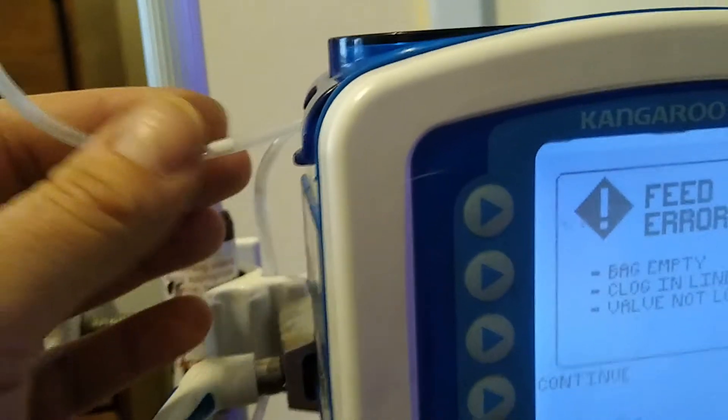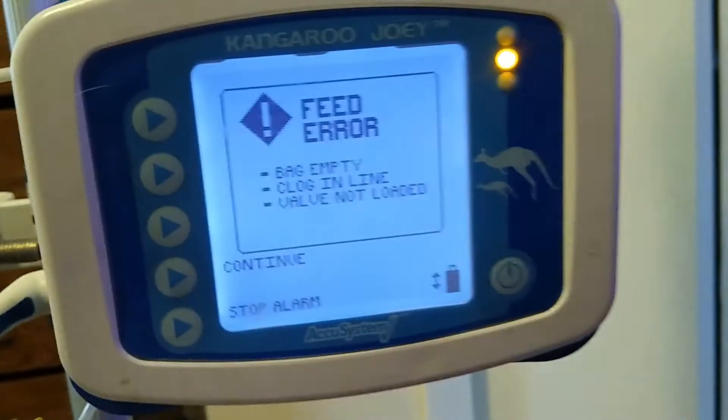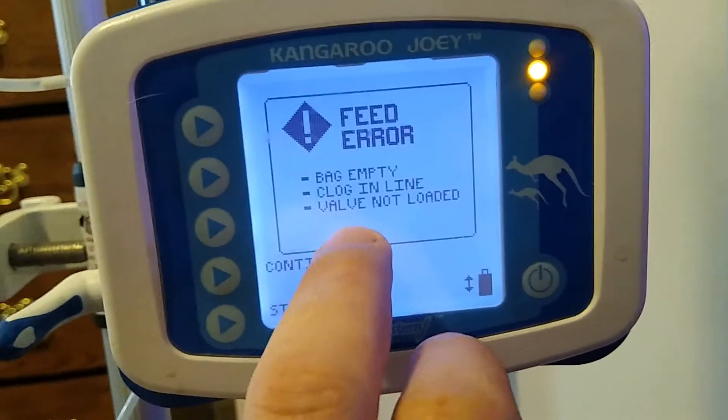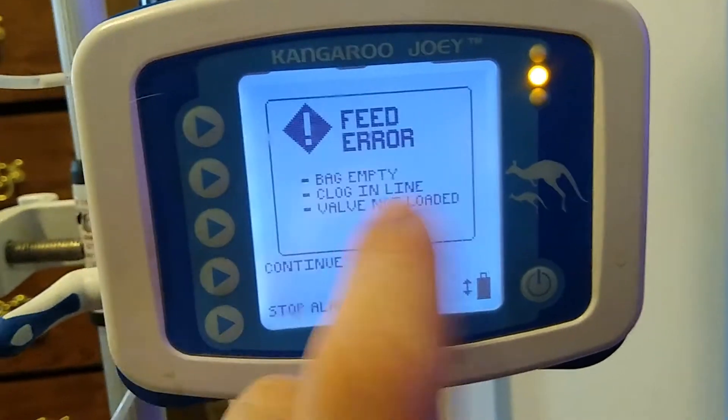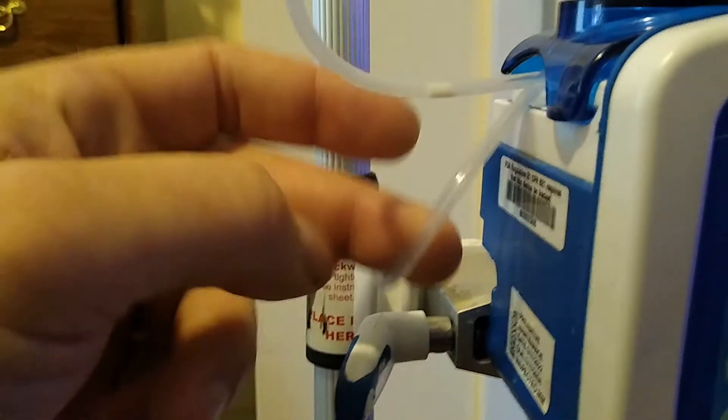So and then there you go. Completely done. This is the air you get when the tube is empty.